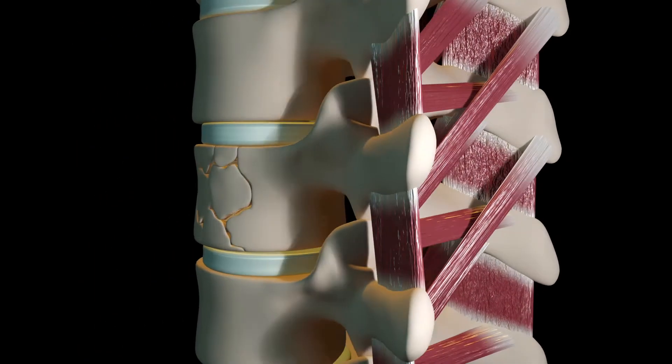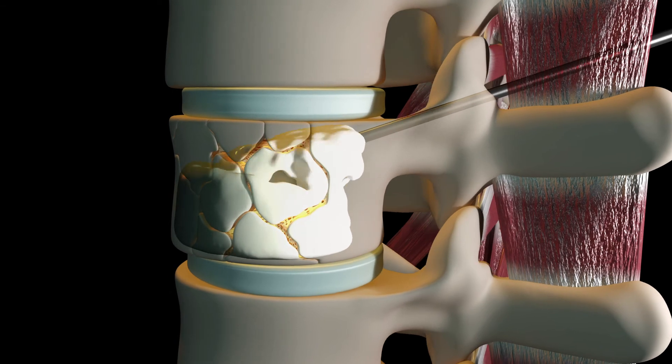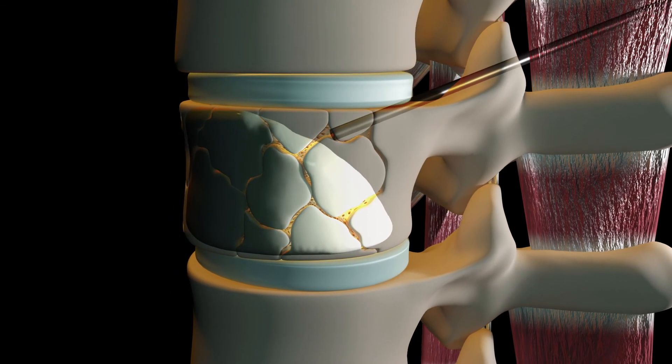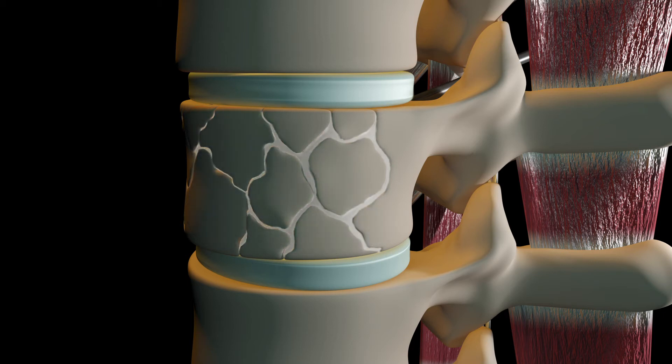As the cement goes in, it's got a space to expand already, and as that cement flows into the void that was created with the balloon, it begins to fill all of the little areas where the fracture is and fill in the bony matrix from the inside. No part of the cement makes it on the outside of the bone — it all stays confined inside the bone, and once that cement is in the body, it rapidly hardens.